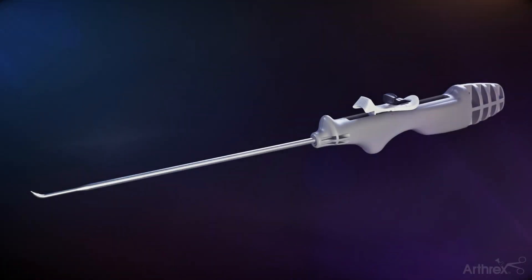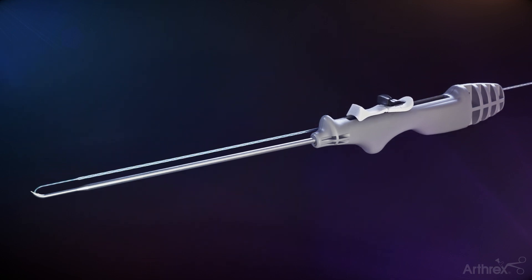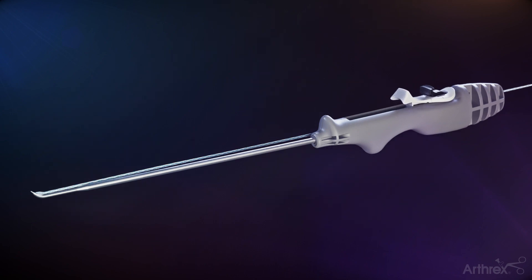Outside the arthroscopic cannula, expose the nitinol jaws of the capsule stitch suture passer by pushing the white sliding actuator down and forward towards the shaft of the device. Once the jaws are exposed, cut the glued portion of the suture and load approximately 5 mm into the nitinol jaw of the suture passer. Push down and then pull the white sliding actuator backward to pull the suture into the needle of the device.